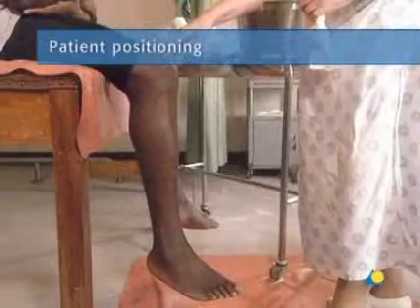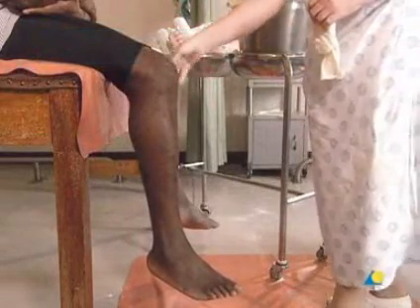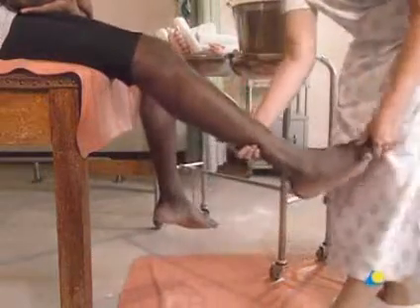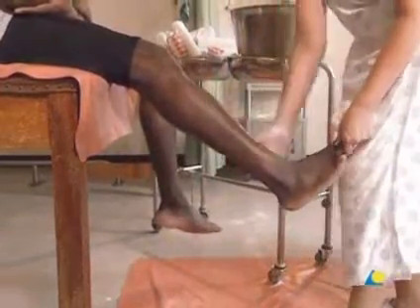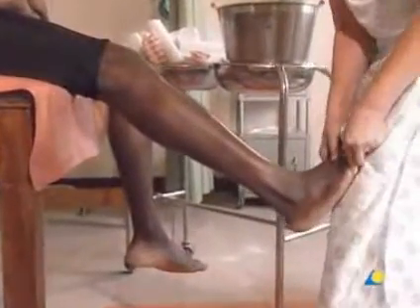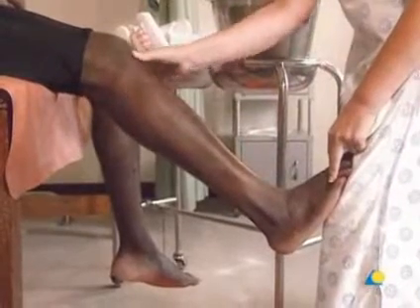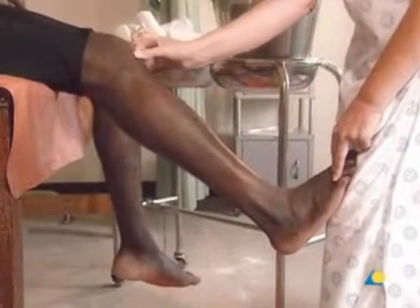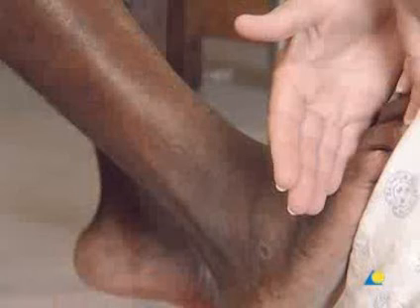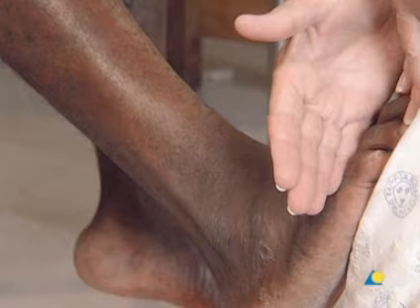The patient should be seated with the knee over the edge of the table. The foot is supported at the metatarsals with the knee, as shown here. The patient's knee should be slightly flexed, while both the gastrocnemius and the soleus muscles should be relaxed. The foot should be plantigrade, and the second toe should be in line with the tibia to prevent inversion or eversion of the foot. The distal border is located at the metatarsal heads and the toes should remain uncovered.